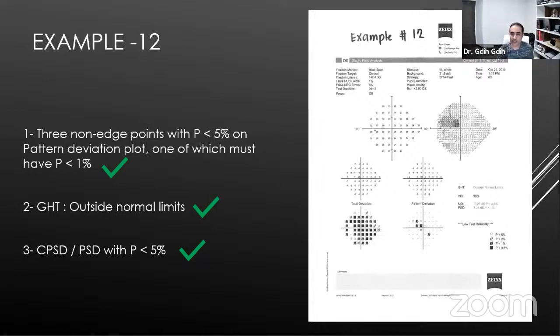Again, we cannot throw out a visual field totally because they have fixation losses. What does the fixation loss mean? At that time, the machine is testing whether the patient is fixating all the time on the test. It will be testing peripheral points, and then all of a sudden it will go back to the area where the optic nerve is, the blind spot, and give a stimulus there.